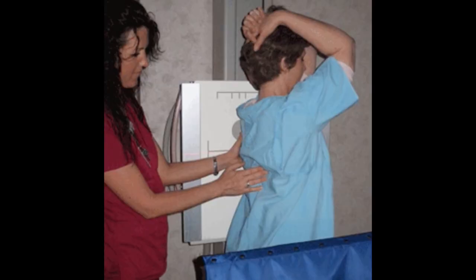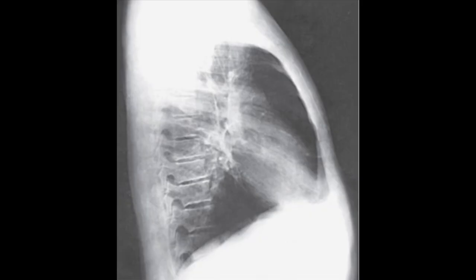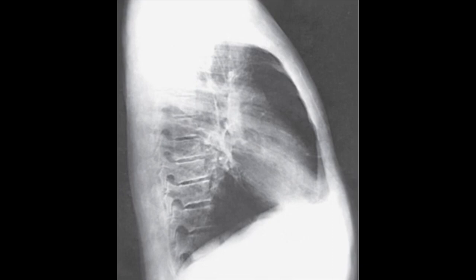The patient's shoulders and hips should be aligned with no forward or backward bending that may distort the lungs. Align the collimated field to enter the patient at the mid-coronal plane at the level of T7, located by palpating the inferior angle of the scapula. Instruct the patient to take in a deep breath, exhale, take in another deep breath, and hold it. These breathing instructions help achieve greater aeration of the lungs with less effort.